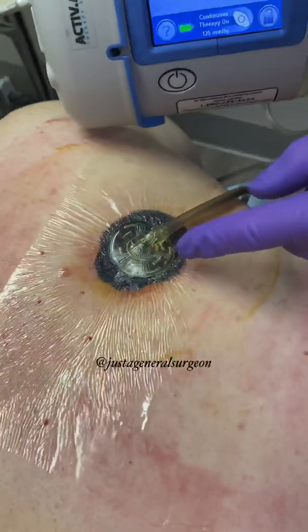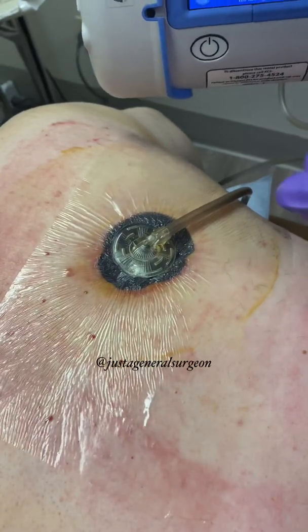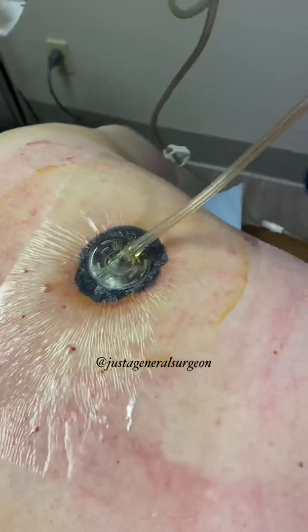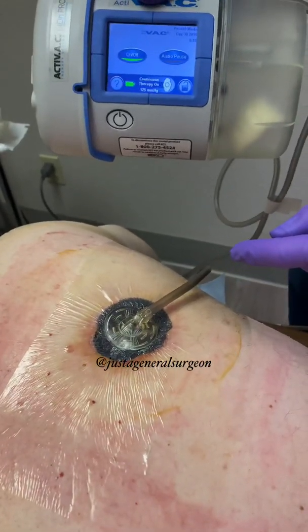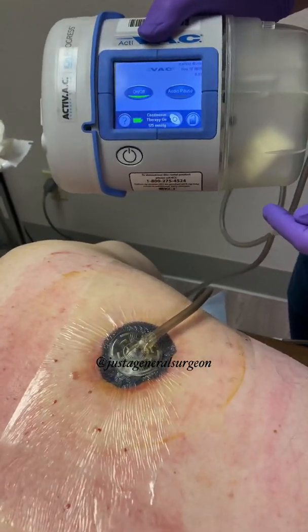This allows the wound edges to re-approximate quicker than just traditional wet-to-dry dressing changes, and also removes the drainage, which is what this tubing system does — that container there. This will be changed every two or three days by the home health nurse, and then he'll come back on a regular basis just to make sure the wound is healing properly.